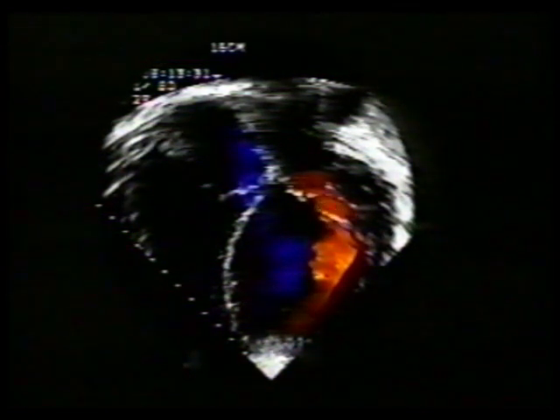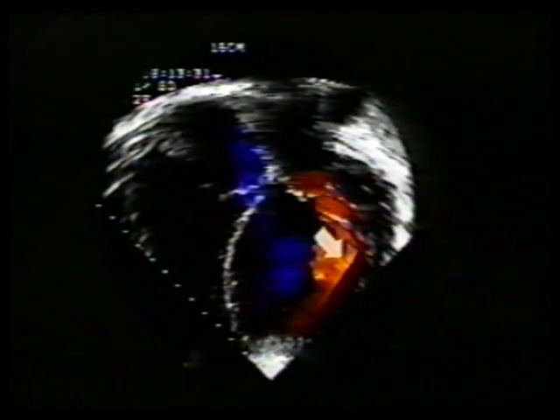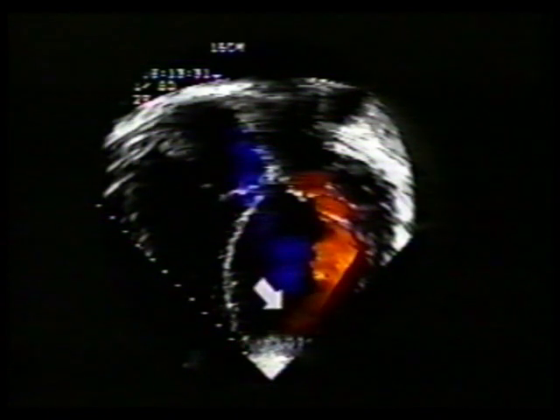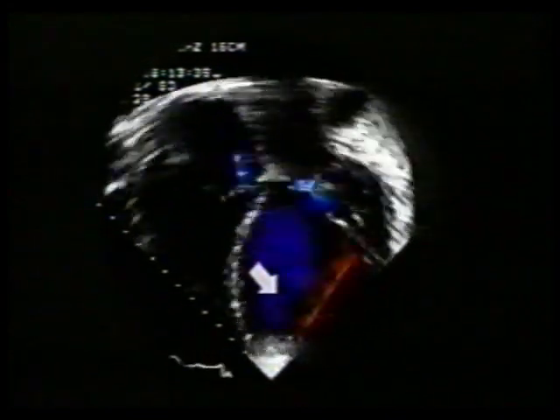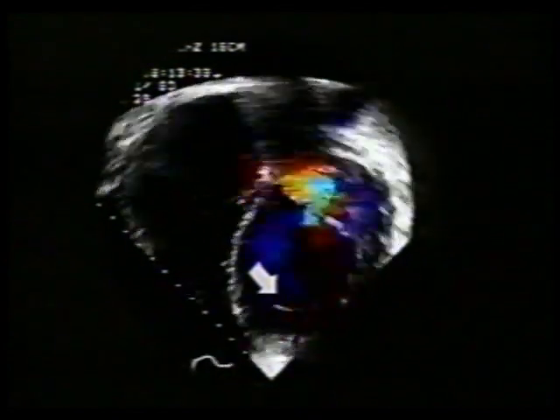Mitral flow in diastole is directed toward the lateral left ventricle. In real time, in addition to mild mitral regurgitation, you will see that in diastole, boluses of red color inflow swirl along the lateral wall towards the apex, and then turn toward the base, becoming encoded in blue. This clockwise swirling pattern of left ventricular filling is typically seen in dilated cardiomyopathy.